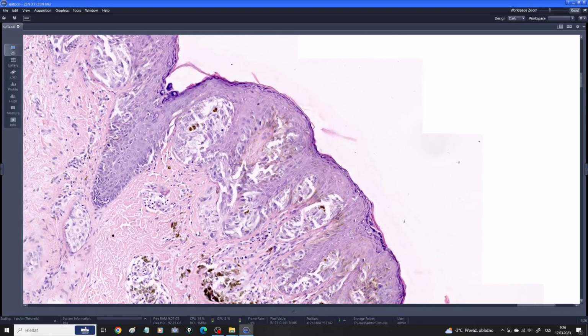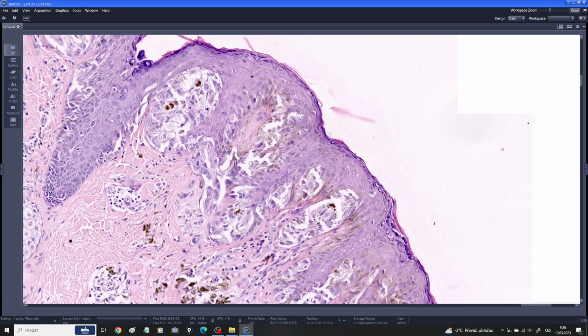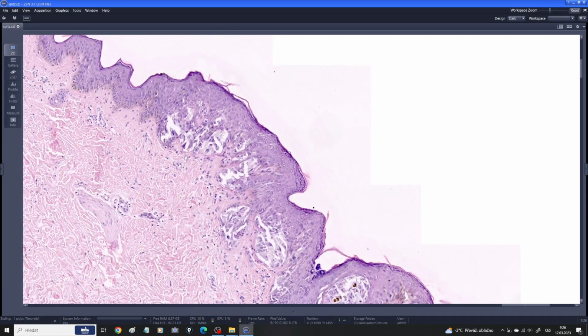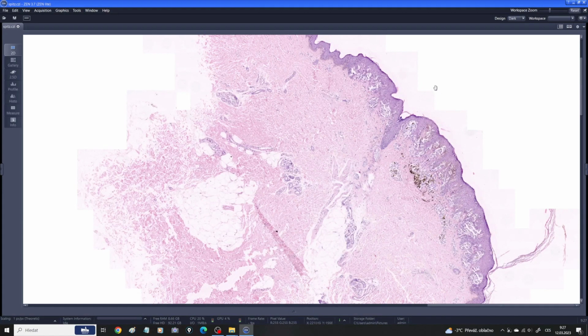And also you can see that the nevus is not exactly bland on the architectural level, because you can see that the nests are irregular as well. Some of them are large, some of them are smaller. Sometimes you can see irregular shapes of the nests, a little bit of fusion of the nests. So this lesion can be quite worrisome on both cytological and architectural level. But still, the lesion is quite symmetric. That's the first thing that should help you.